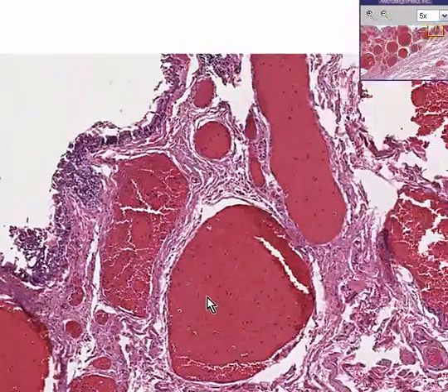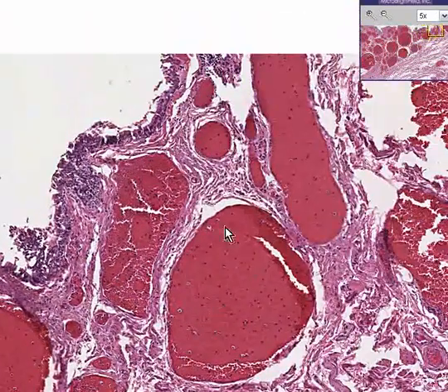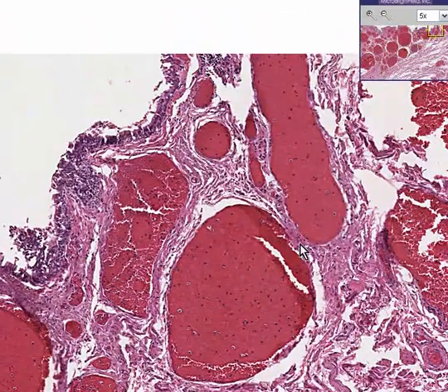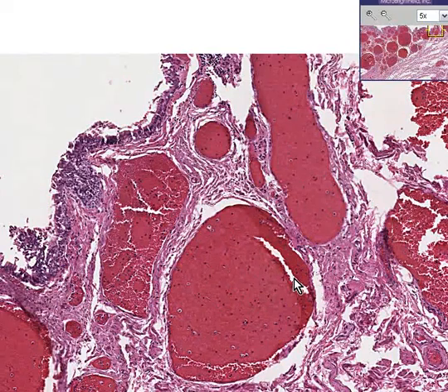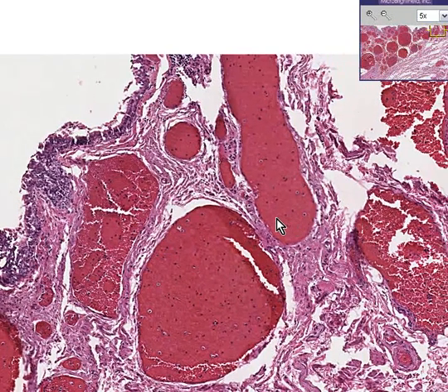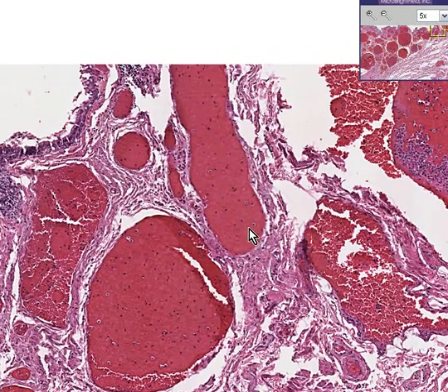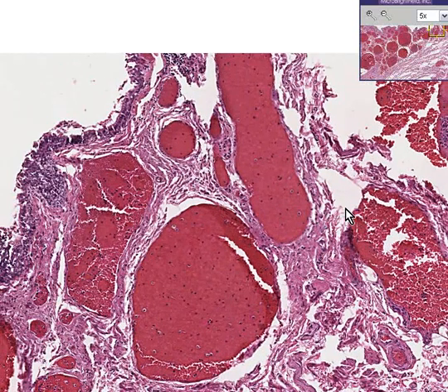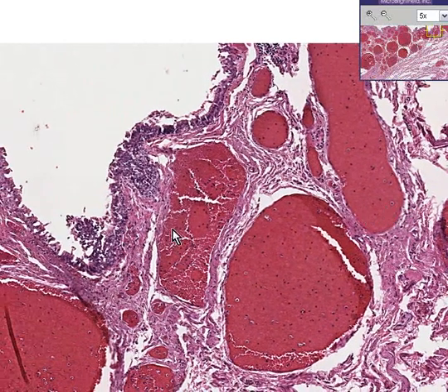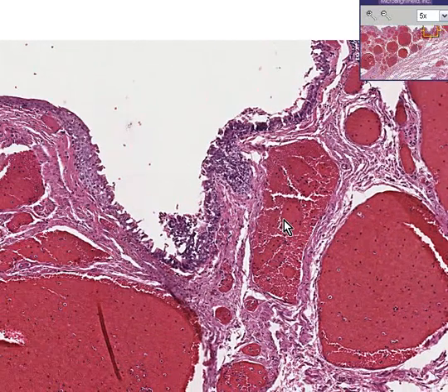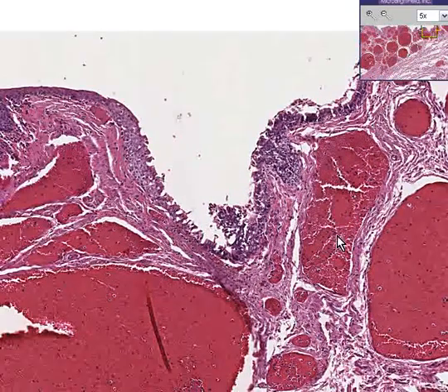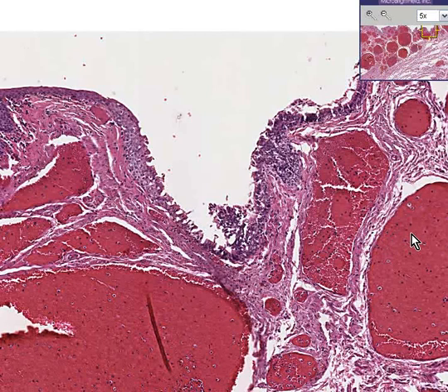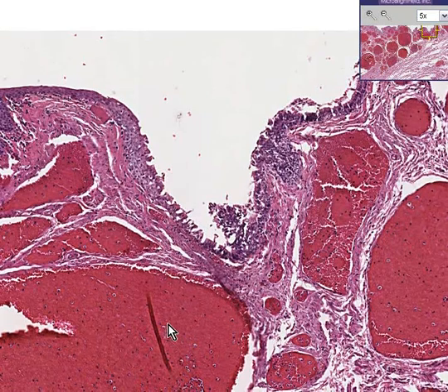The internal hemorrhoidal vessels are drained into the portal system, and they are on the other side, or the columnar side, of the pectinate line.